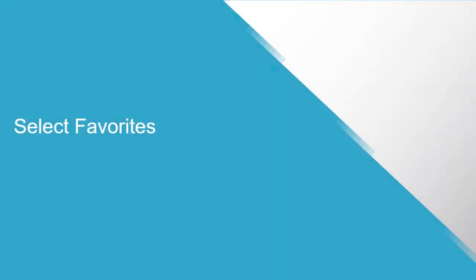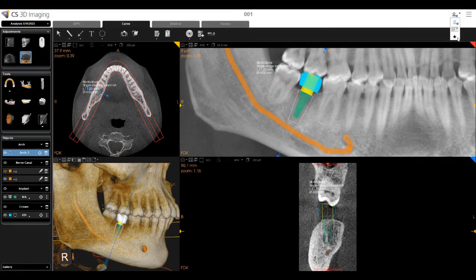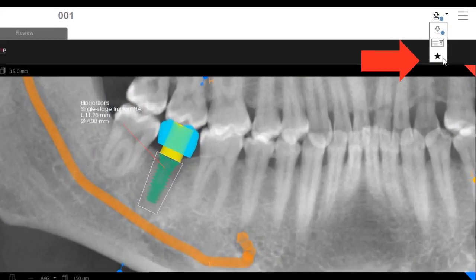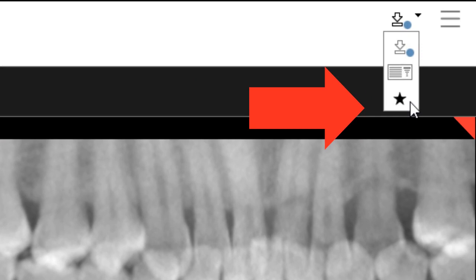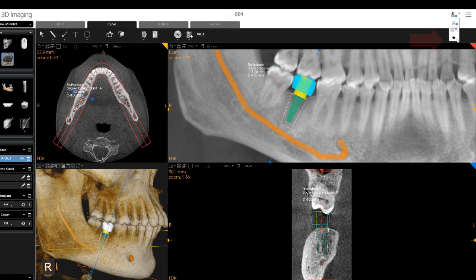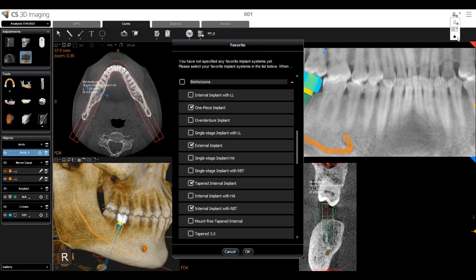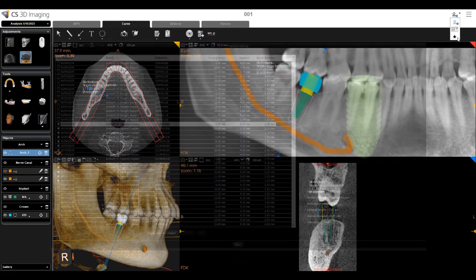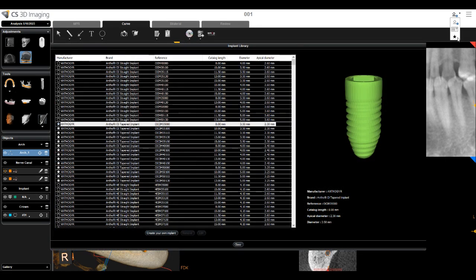Select Favorites: In the Implant Library Management drop-down, select Favorites. In the Add Favorites window, select Favorite Implants. When finished, click OK. Favorites are indicated by a star in the Implant Library.